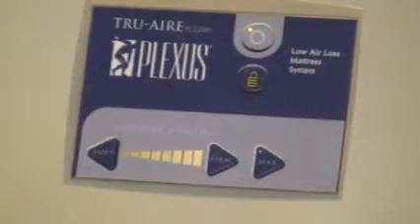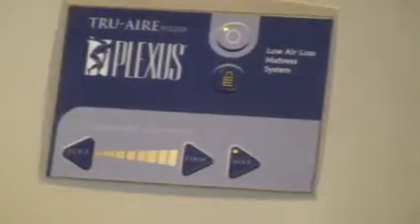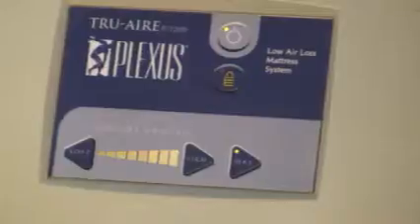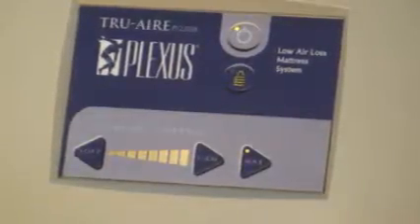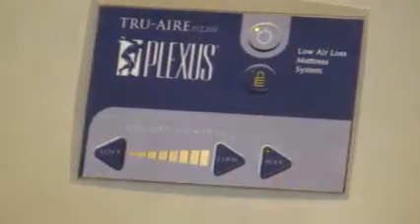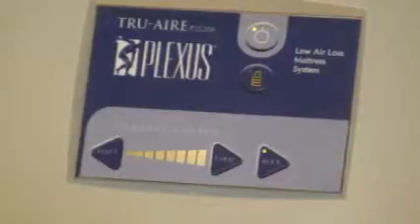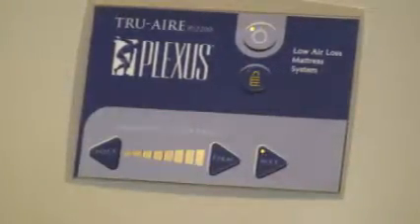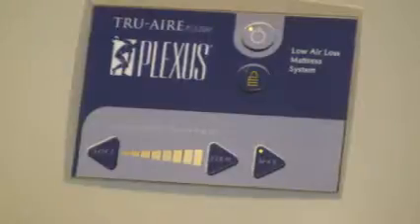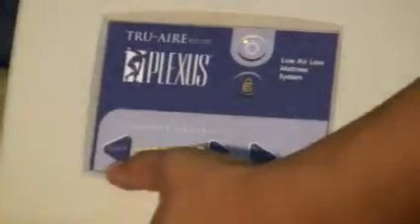Nurses and caregivers may also use the max inflate in order to care for the patient, change dressings, and position the patient, turning the patient side to side. Making the mattress firmer will help with those tasks at hand. If for any reason max inflate is activated on your low air loss overlay, it does have a patient safety of 30 minutes. After the 30-minute time, it will automatically shut off and go back to the normal operating comfort control setting selected.